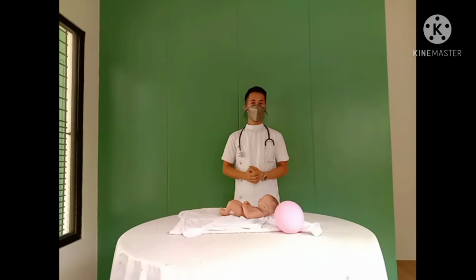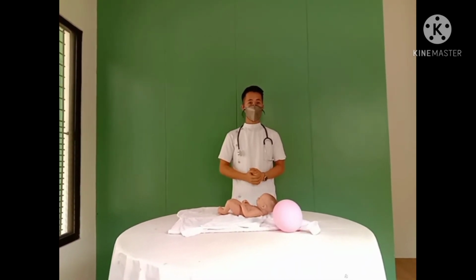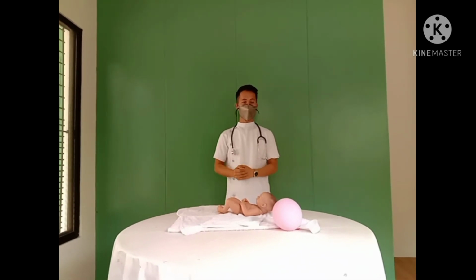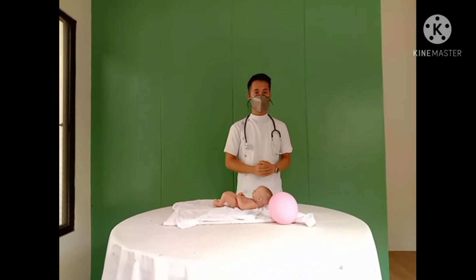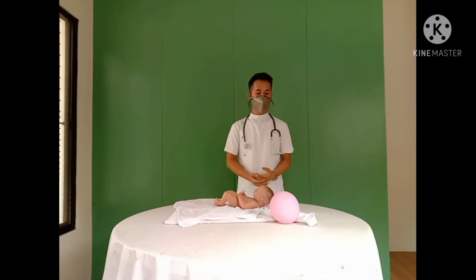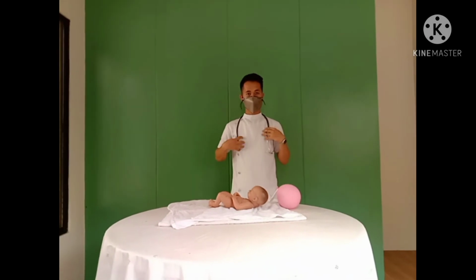To show you when you need neonatal resuscitation. Before anything else, I am GC Bailon from CPAC. I am a nursing student too. Before we proceed, we should always prepare the equipment like the towel and the ambu bag and, of course, the stethoscope.